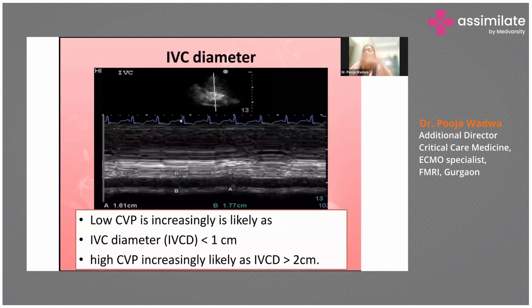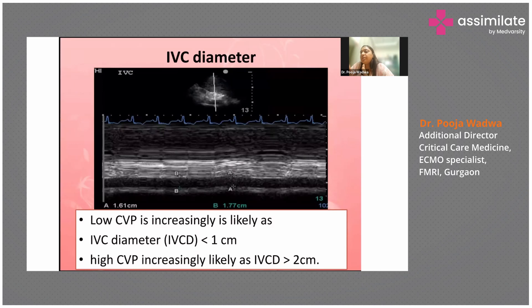This is the IVC diameter on M-mode. We have already measured it for a few respiratory cycles — the variability is 1.6 to 1.7 cm. Low CVP may be because of hypovolemia. When the IVC diameter is less than 1 centimeter, CVP is low and the patient requires fluids. If the IVC diameter is more than 2 centimeters, the patient is more than adequately filled and may require diuretics. Here the IVC is around 1.6 to 1.7 cm — the patient is adequately filled.